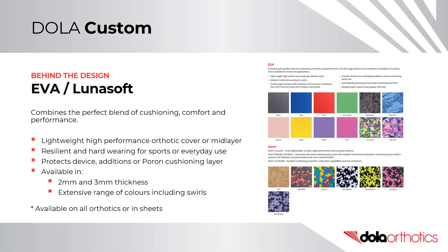EVA and Lunasoft combine the perfect blend of cushioning, comfort, and performance. They are a lightweight, high-performance orthotic cover or mid-layer. They are resilient and hard-wearing for sports and everyday use. They can be used to protect the device, additions, or a pour-on cushioning layer.